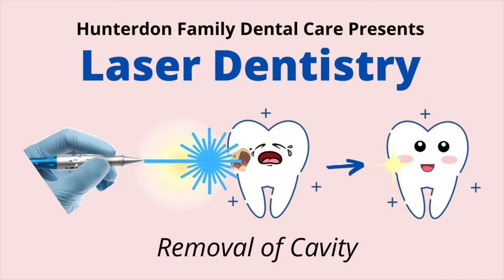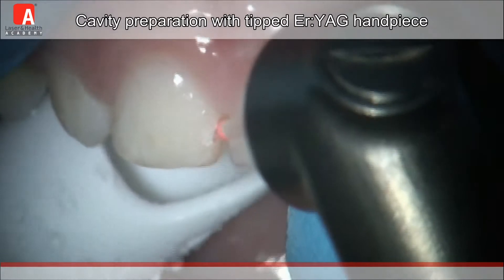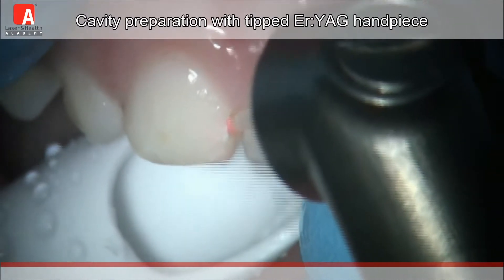While watching this video, you'll get to see how the Fultana laser can be used as opposed to a traditional drill when treating cavities. As you can see here, the laser is removing the decayed tooth structure while preserving the healthy tooth structure.